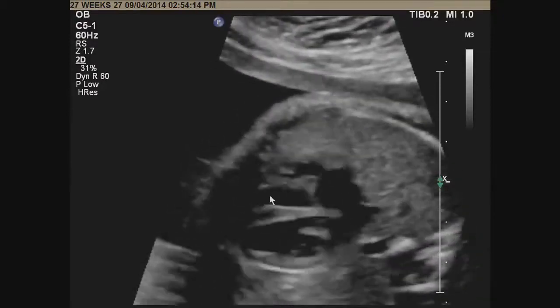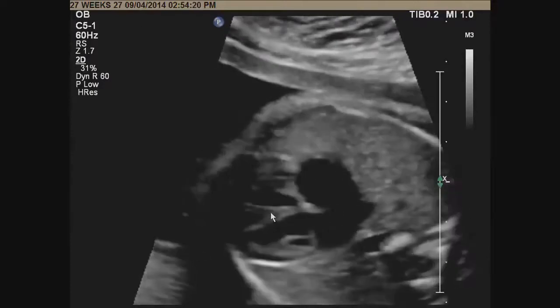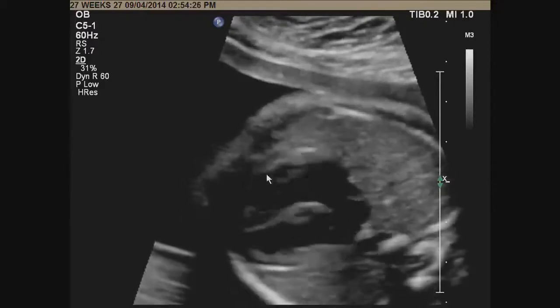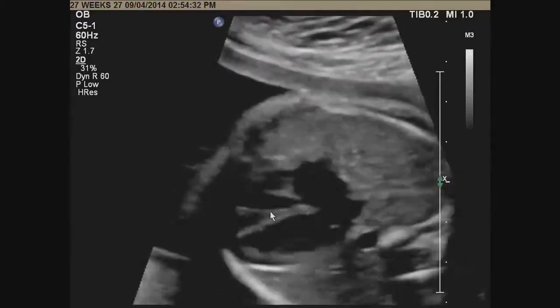That's probably the optimal way to look at the septum on color Doppler, because it allows you to detect very small muscular VSDs. You see blood flow across, because you're parallel to the orientation of flow. So your cosine in the Doppler equation of 0 degrees equals 1. So you actually are not attenuating any blood flow by doing it that way.